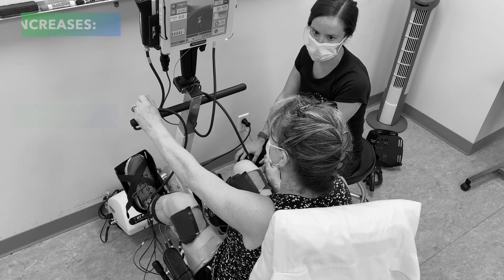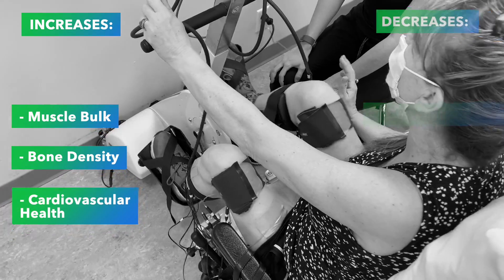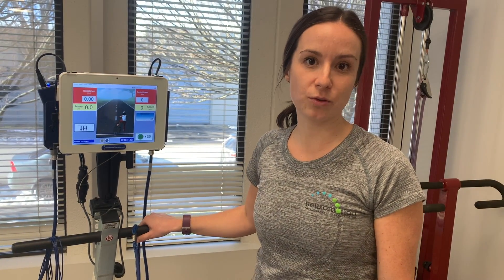FES cycling can increase muscle bulk, bone density, and cardiovascular health, while decreasing body fat content, risk of diabetes, and spasticity in stimulated muscles. The FES bike is unique to our Victoria location.